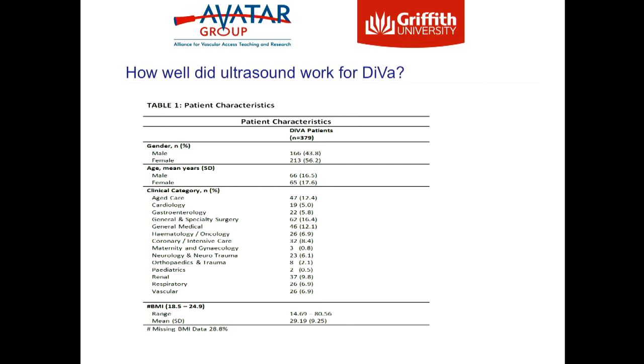I guess because of the way we taught the after-hours CNCs, the basilic veins were the most prominent vessels used. So they were the ones in the bicep. Because most attempts were done in the forearm and in the hand, the brachial veins seemed to be the best that we could go where there probably wasn't going to be any thrombus or any issues. And we used a variety of different devices as well. And primarily they were typically for IV antibiotics.